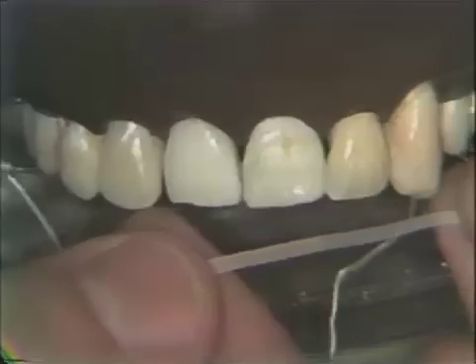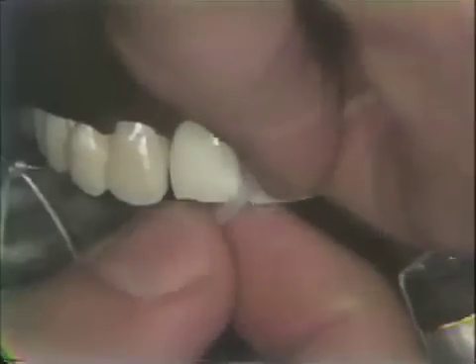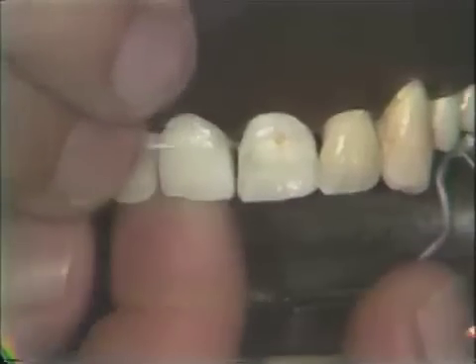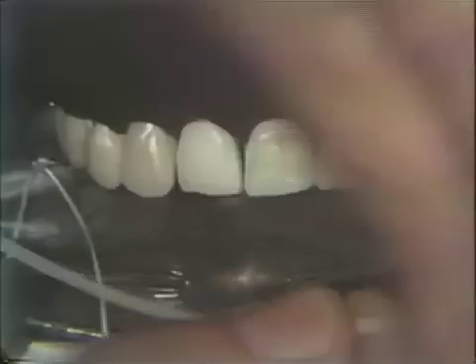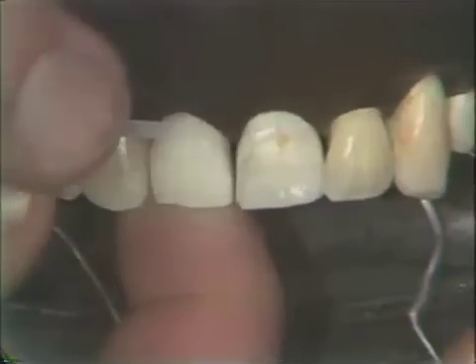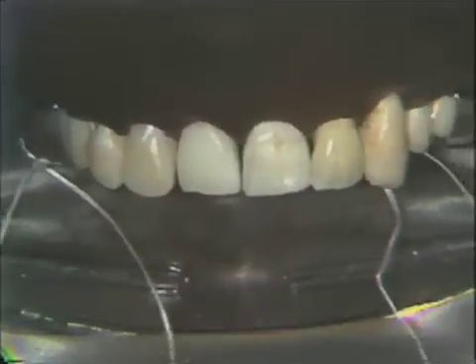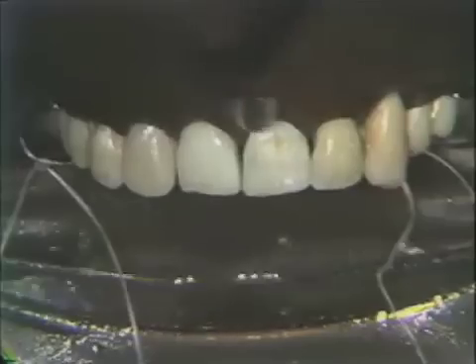Now the strip that you saw earlier, the coarse side is on the left, but there is a place with no grit on it in the middle so that we do not touch contact. Now notice, that was placed through and then pulled and rubbed against the cervical. You place your thumb or finger against the tooth and the strip on the lingual, and then pull it out, and that finishes the cervical down very beautifully for you, keeping contact with that finger or thumb against the lingual. Rinse it off and check.